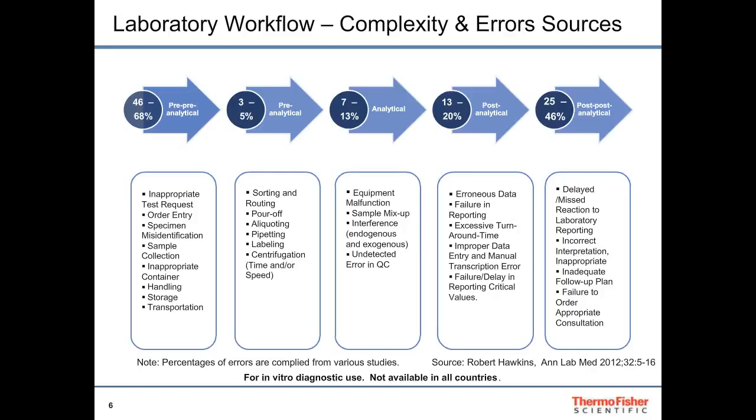Once in the laboratory, the samples must be prepared properly. The laboratory is also responsible for properly preparing reagents, instruments, and software to measure what needs to be measured in each sample. The data that is generated must be carefully reviewed and reported. Those who ordered the test must not only receive correct reports, they must understand the manner in which the results are presented in order to properly interpret and act on the results. The second highest percentage of errors occurs during this phase.